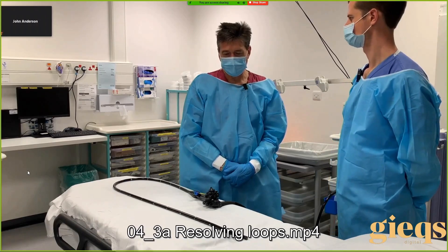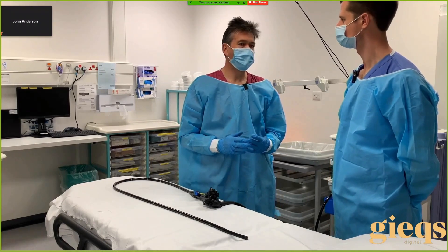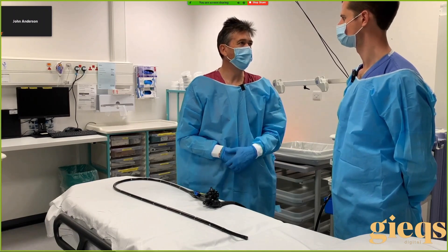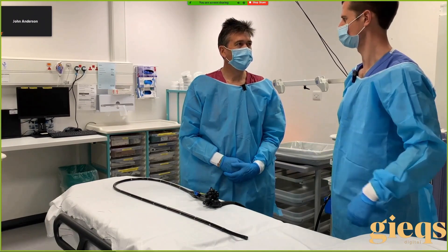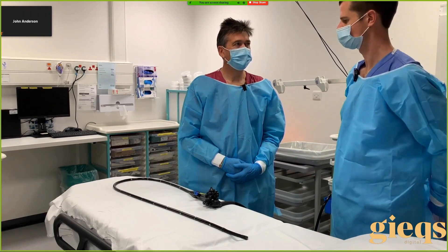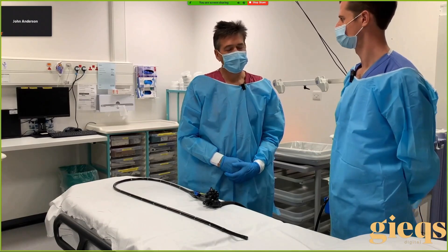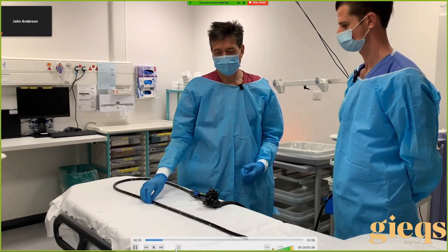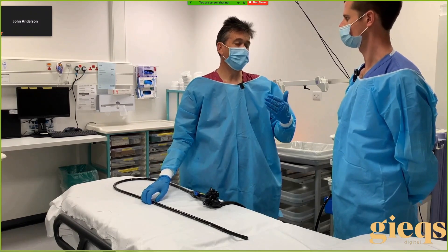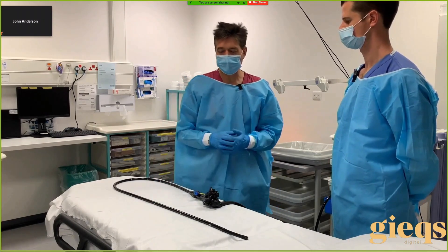This is about loop formation but more importantly loop resolution. Most trainees are very aware they're forming a loop because of the following signs: you can feel it's becoming more uncomfortable in your handling of the scope, you're getting less effective torque, and the patient is often more uncomfortable as well. You get increased resistance, lack of progression, or sometimes a paradoxical movement.